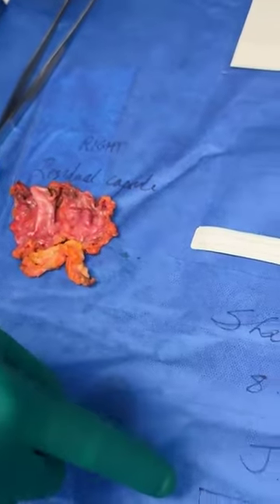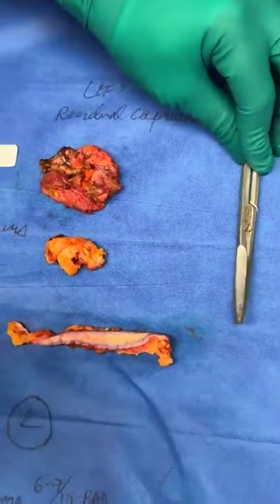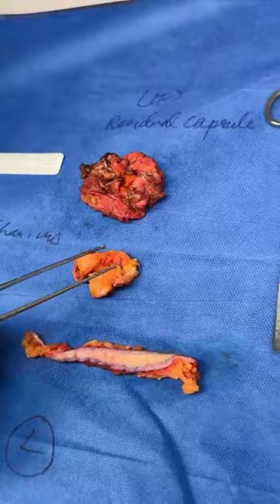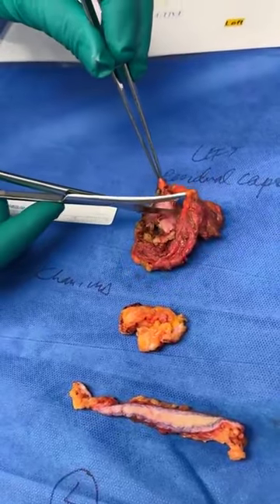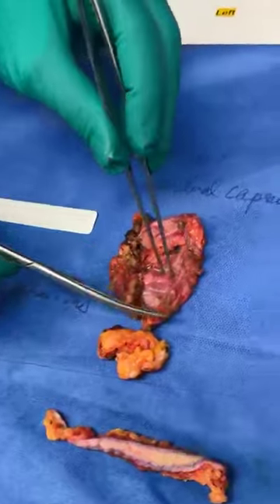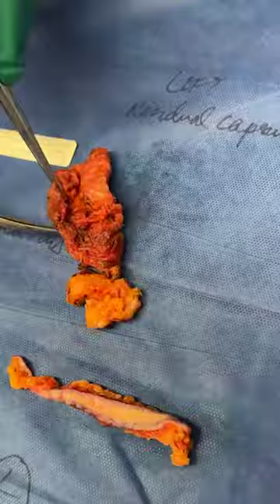Now, on the left side, this is the left residual capsule. Again, likewise, as you will see, you have the skin that was removed to help with the contouring. This is the soft tissue at the bottom of the capsule. And this is again the entirety of that capsular tissue that was removed right on top of the rib. And as you will see right here, this is the fascia of the serratus anterior, fascia of the pectoralis minor, fascia of the pectoralis major superiorly, the periosteum, perichondrium, all of it was completely removed.